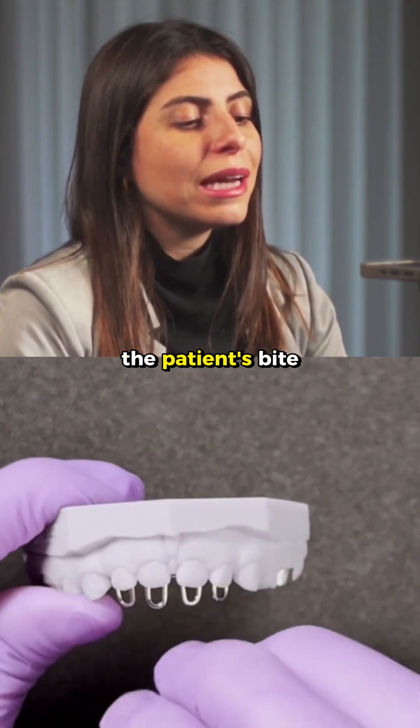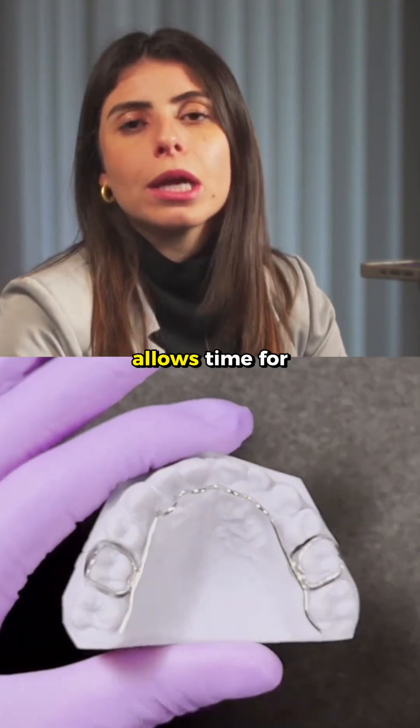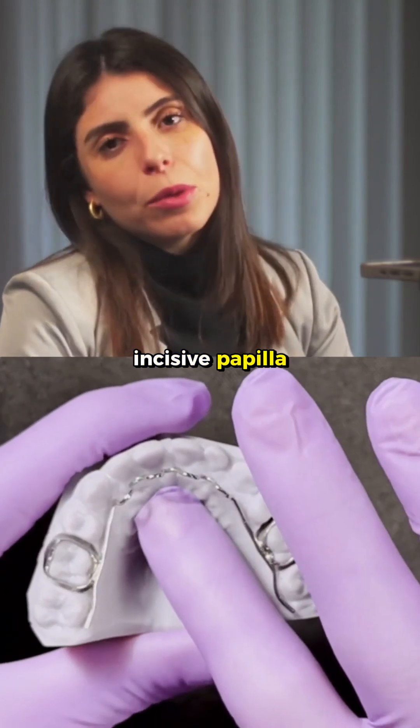After I close the patient's bite, I usually leave it for a period of three to four months or more. This allows time for the tongue to adapt to its new position, where the tip of the tongue should rest on the patient's incisive papilla.